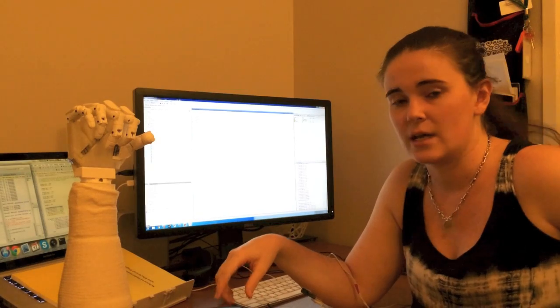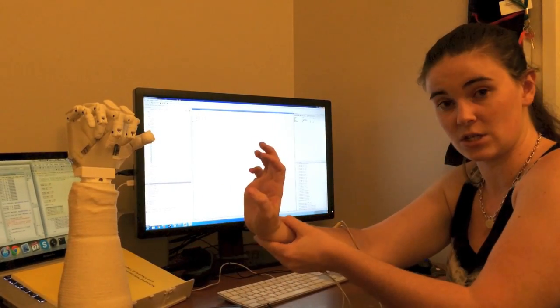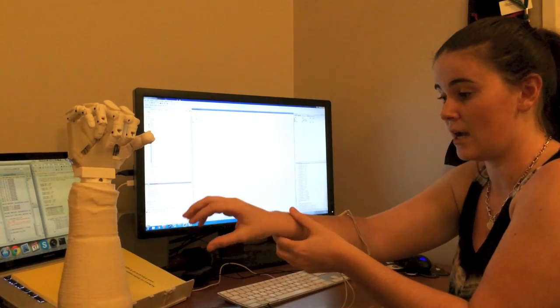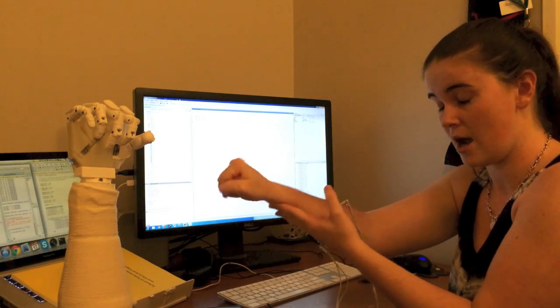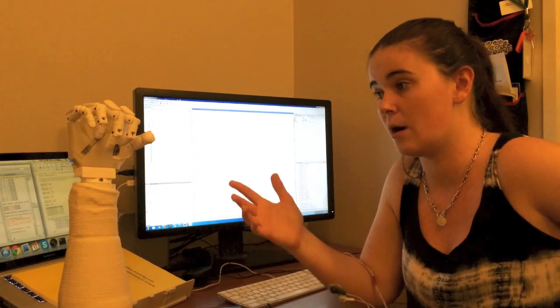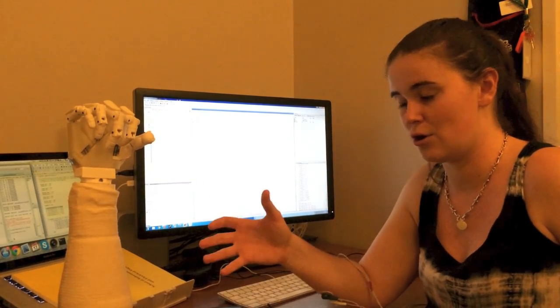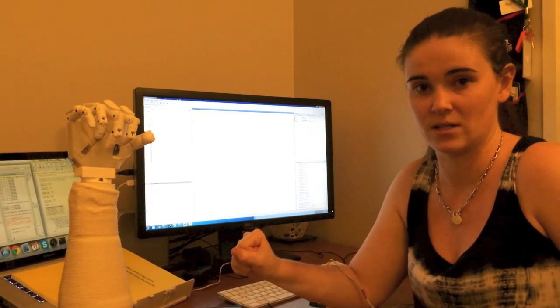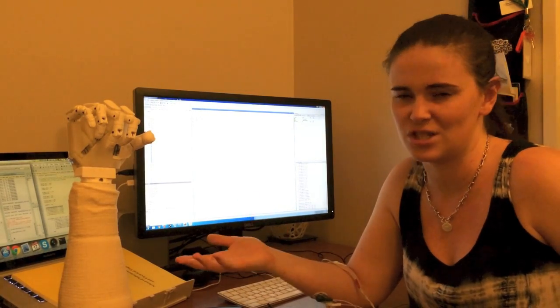Alrighty, so what you saw there is the rotate left and the rotate right in the wrist. I've mapped that to extension and flexion. So what that hand just did is it took an extension motion, a fist motion, and then a flexion motion, and it glued them all together to make that series of motions. You probably guessed that something like turn, make a fist, and turn back again is more useful than just make a fist. The interesting thing is you can now map multiple gesture patterns to that.